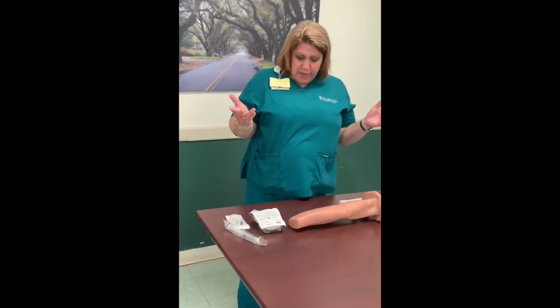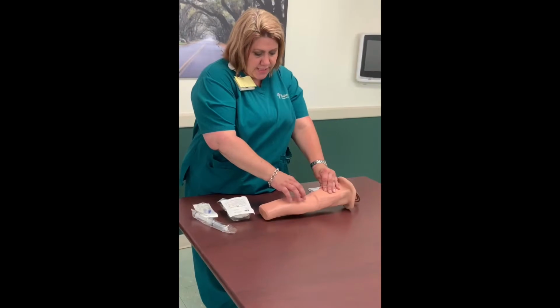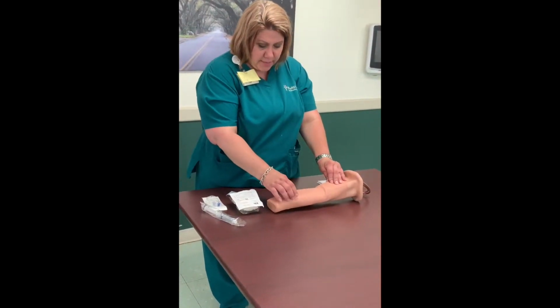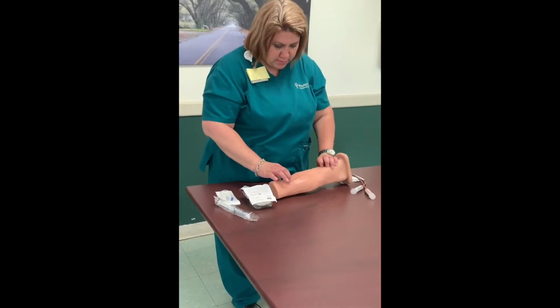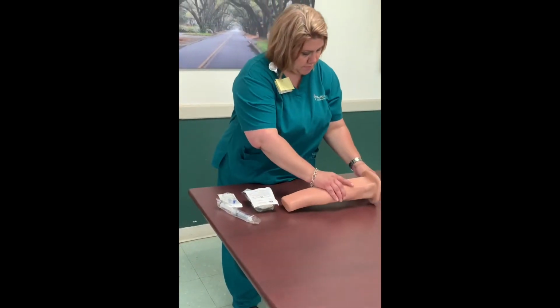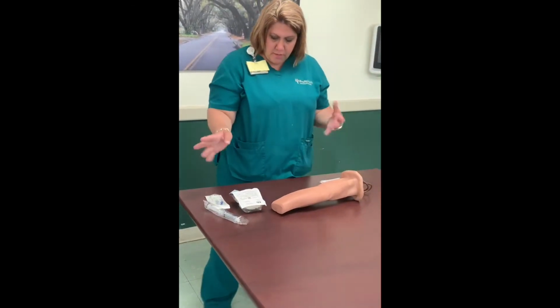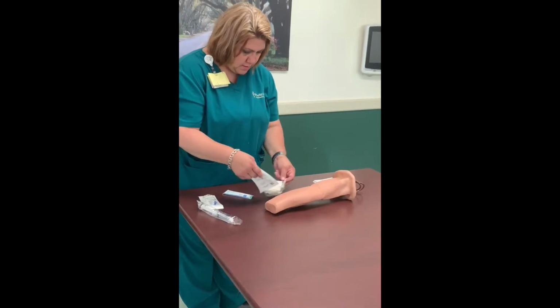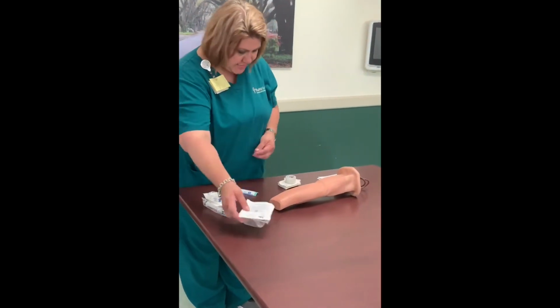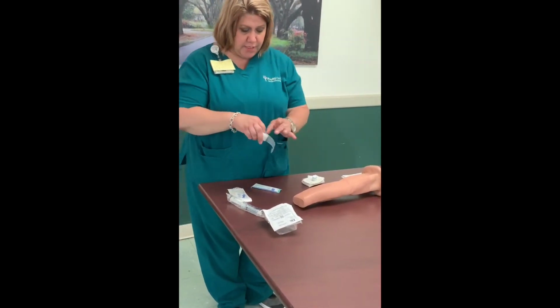So you want to prepare the patient. You want to look for any prominent veins, which means anything that's sticking up. Just kind of feel around for a good vein, find a good one. So once you found one that you think is going to be good, take all your supplies out. I like to go ahead and get my tape ready that I'm going to use.